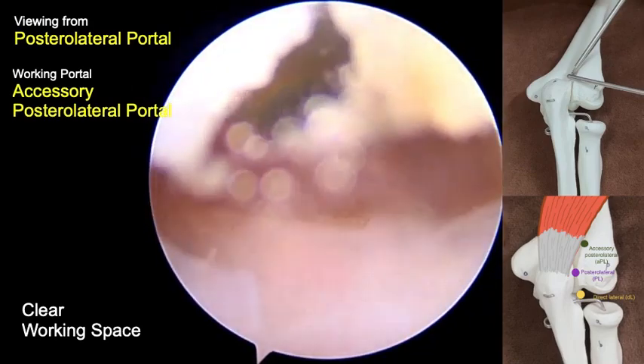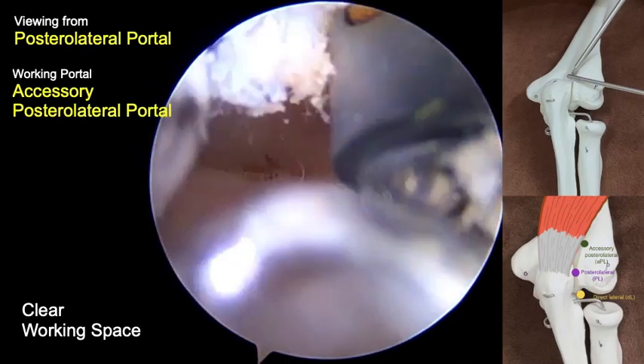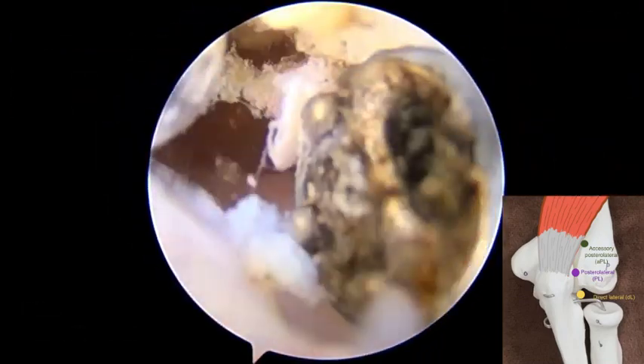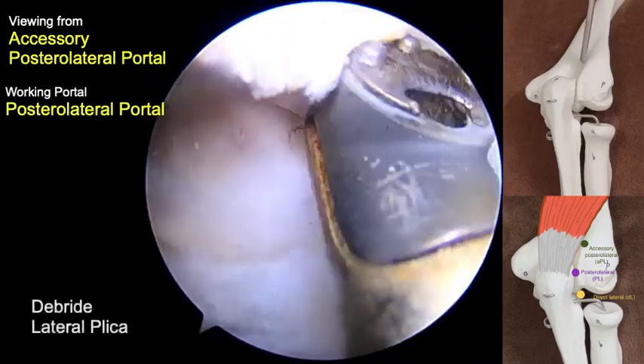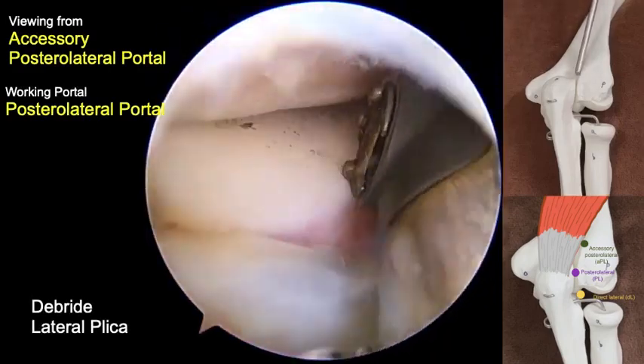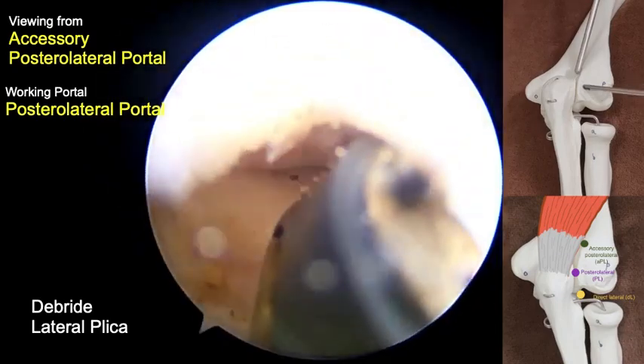The insertion is lateral to the triceps muscle, then the soft tissue was cleared to extend the working space. The instruments of the two portals were swapped, and these two portals can be interchangeably used for working and viewing.